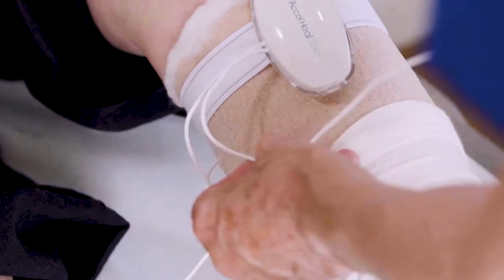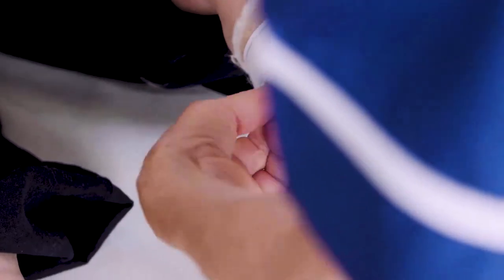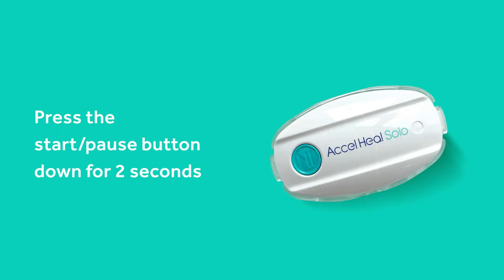Once you have completed the compression bandages, you are ready to connect the Axel Heal Solo device to the electrode pads. Connect the treatment device to the electrode pads by pushing the electrode connectors into the electrode pad receptors. Activate the treatment by pressing the start pause button down for 2 seconds.